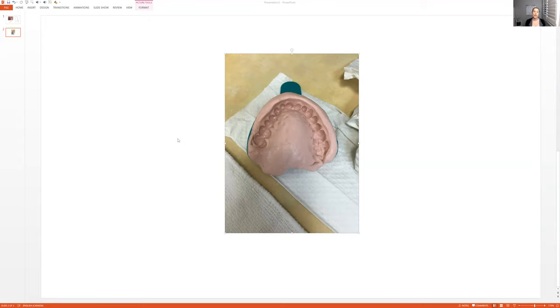What you want to do is obviously have the patient sit down, put on the bib, explain it to them. So if they're having it for whitening impressions or a night guard, say to them, you are here today for your night guard impressions. Have you ever had impressions before?